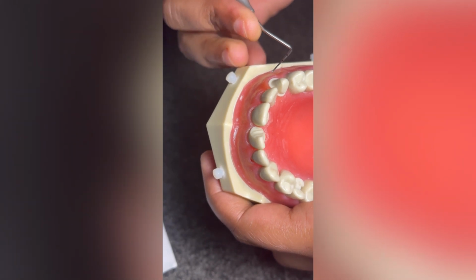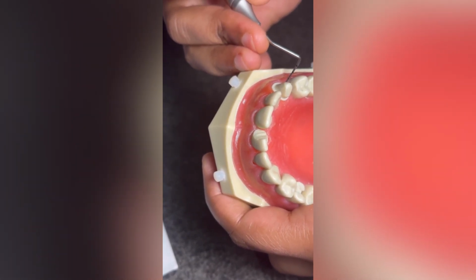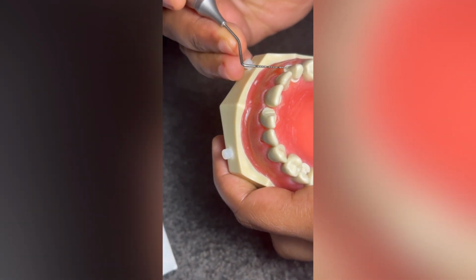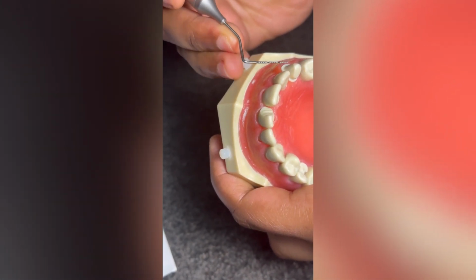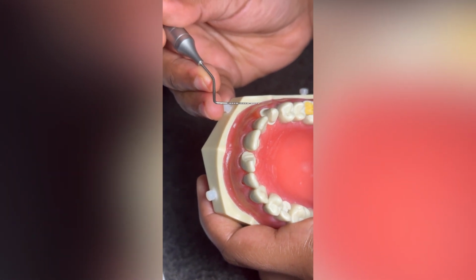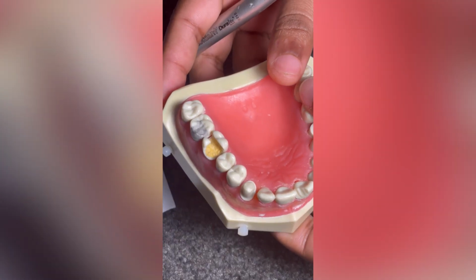So basically you check, when you mean facially, it's from this point until this point. At some points I would say it is only 1 millimeter, which means that you might fall under borderline.